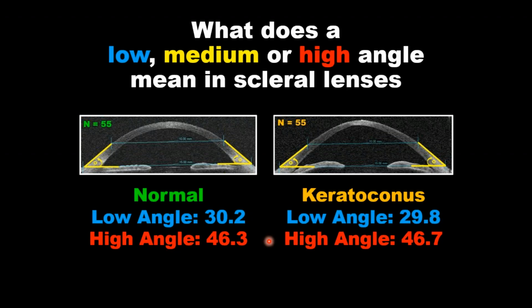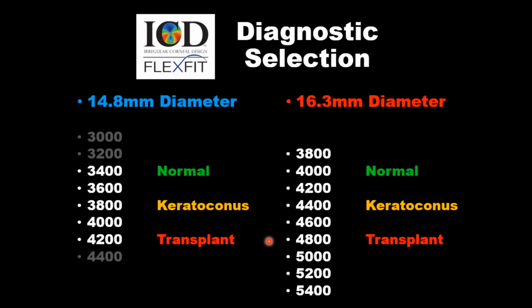So really, there isn't a whole lot of difference out beyond the cornea. Apparently, keratoconus is, as described in the textbooks, a corneal thinning disorder. The action is in the cornea. So that's why your trial set can be used on a normal eye with ocular surface disease.